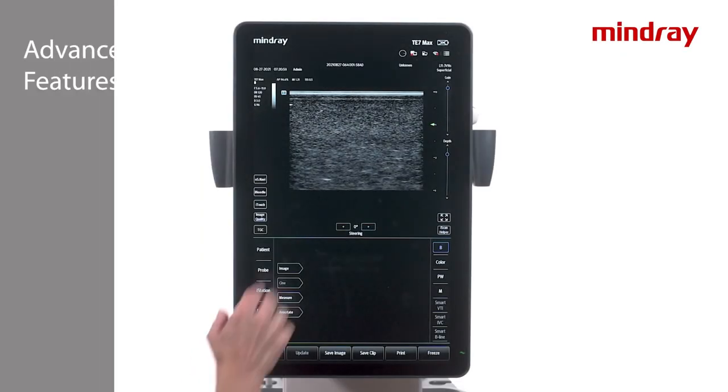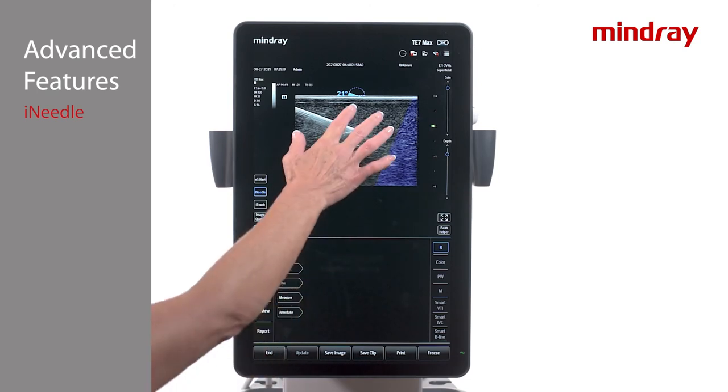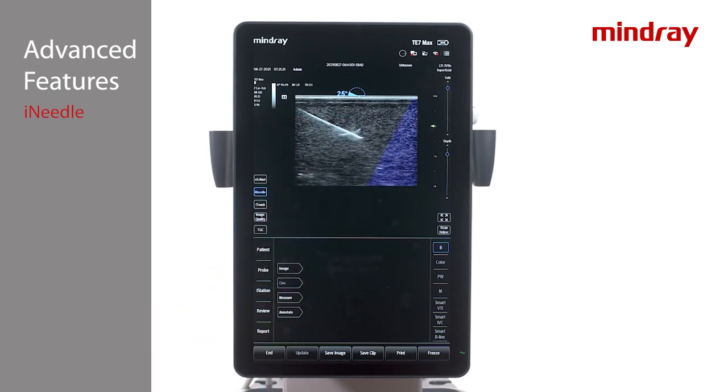Choose iNeedle on the left of the monitor. iNeedle is compatible with all linear and curved transducers. This needle visualization software is based on beam steering and only functions for in-plane procedures. The system electronically steers the ultrasound beam towards the perpendicular interface of the needle, thus enhancing the needle appearance.